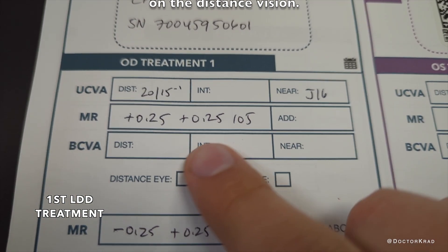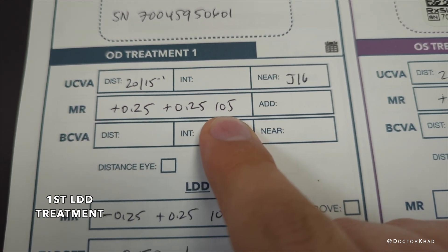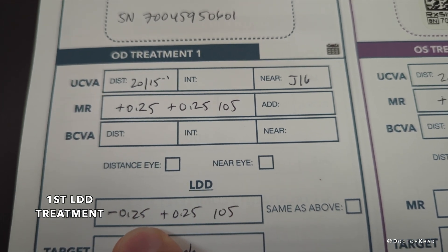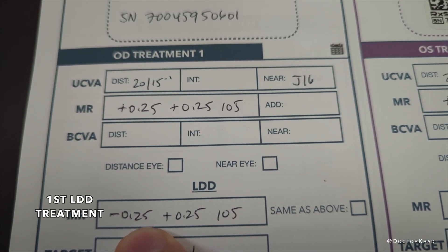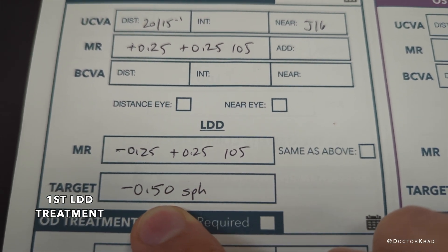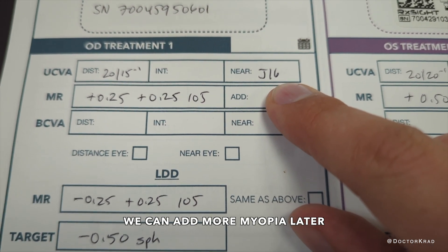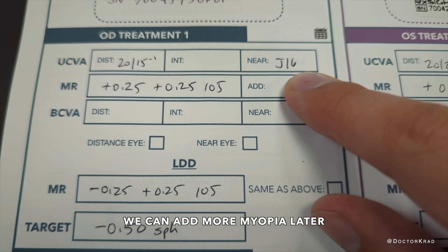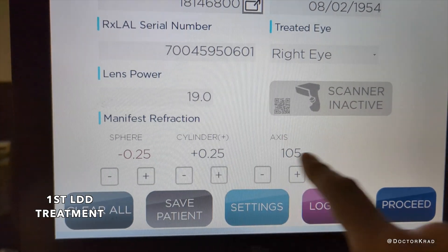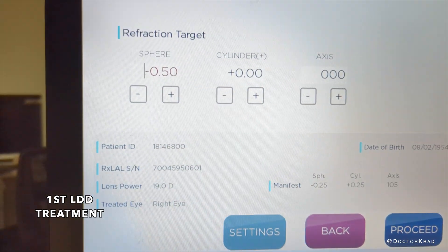His actual refraction is plus a quarter, plus a quarter, 105. We're going to say it's minus a quarter, plus a quarter, 105 — so we're half a diopter different — because our target is actually plano, but to get the extended depth of focus, we're going to tell the machine that the target is minus 0.5. Hopefully his reading vision gets better from J16. Even though he's plus a quarter plus a quarter, I put minus a quarter plus a quarter, and we're targeting minus a half.